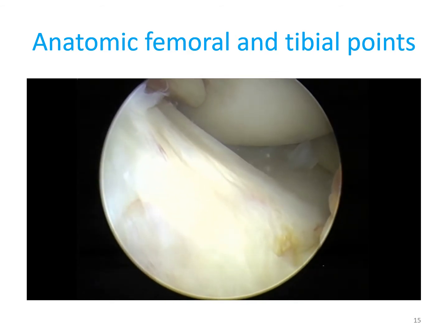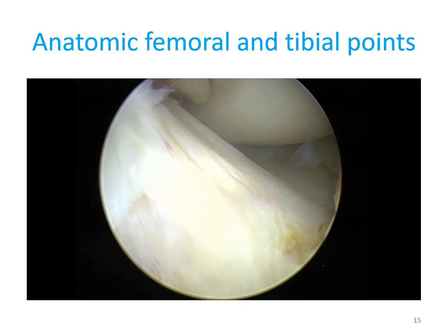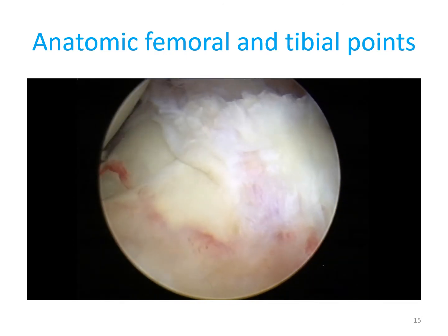It's a really large area of attachment. Please leave these fibers because you need this collagen fill.